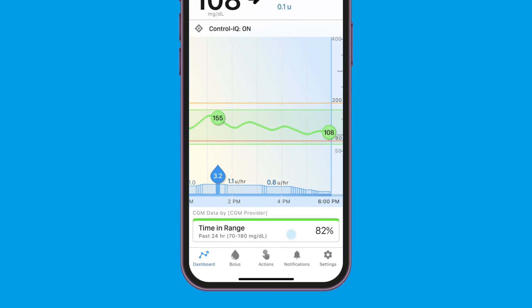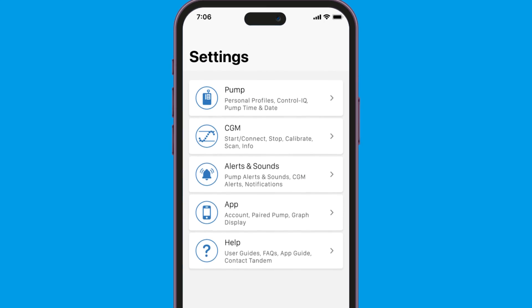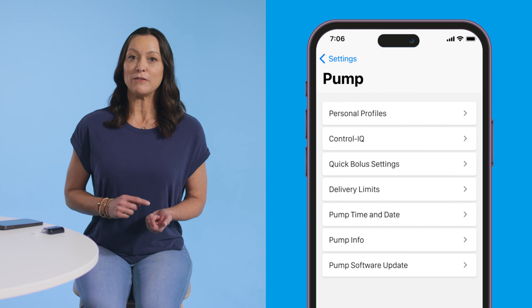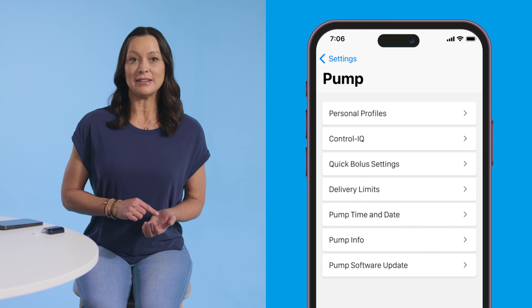You can choose to program the quick bolus by selecting either units of insulin or grams of carbohydrate. To set up this feature, tap Settings, then tap Pump. You'll need to verify your identity using your smartphone's authentication feature to access the pump menu.